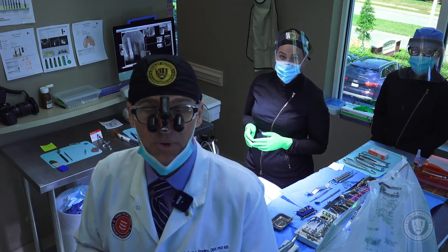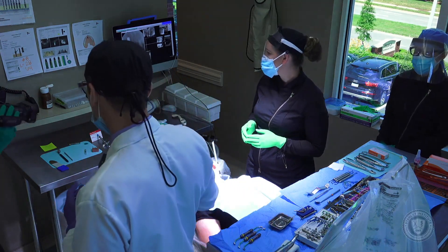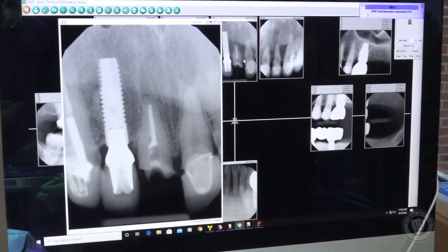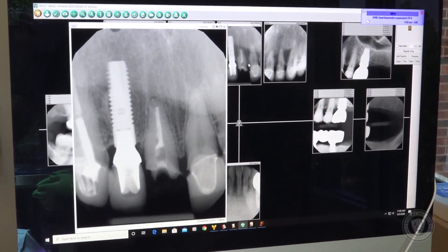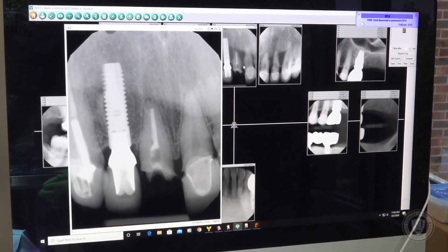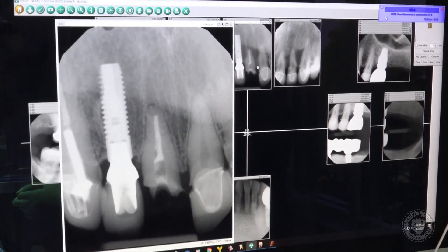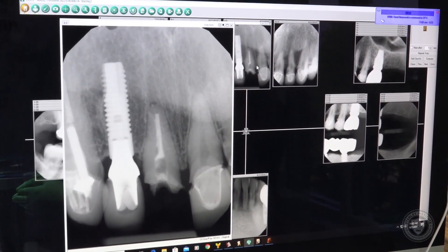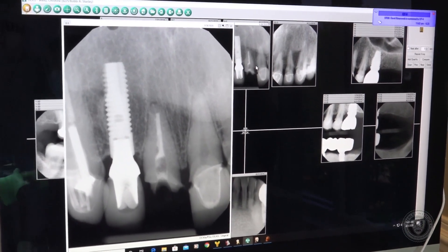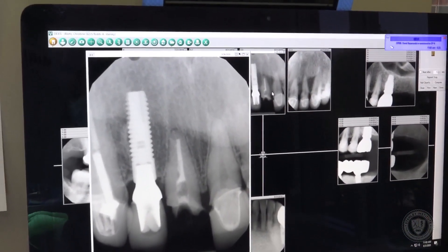Let me show you what we're working with on the radiograph. In the seven position we have an existing implant. In the eight position, the crown has fractured off at the gum line — it's previously root canaled. There's a crown on nine. We're working between two sticky situations: we don't want to knock that crown off on nine, and we don't want to damage bone around the distal of eight and mesial of seven where that implant is, because that implant bone doesn't hang around well if you damage it.